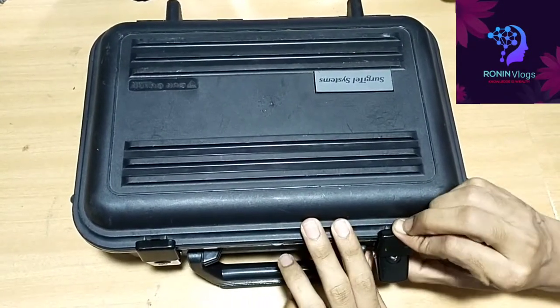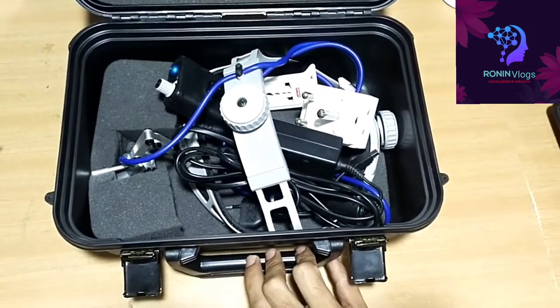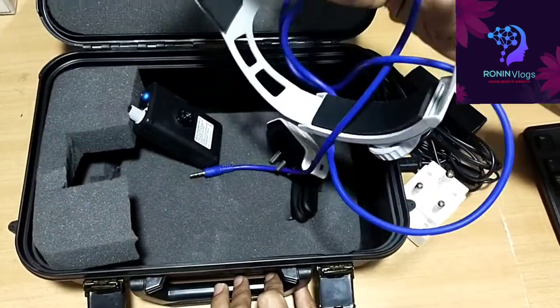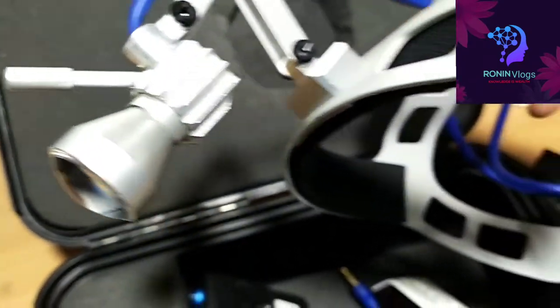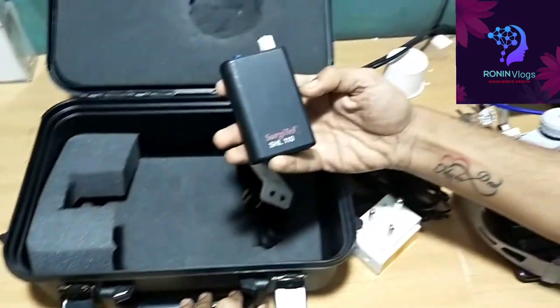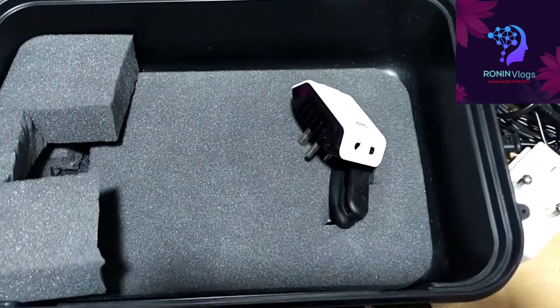Hello friends, welcome to my YouTube channel. Today in this video I am going to show you the SurgiTel Systems headlight. This is mainly used in OT during surgery. This is a charger and one adapter. The headlight system company is SurgiTel. This is a headband, and the battery model is SHL110.